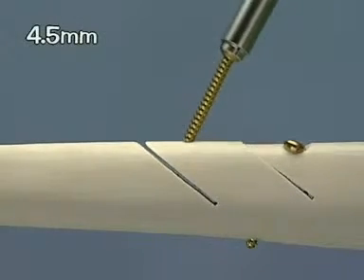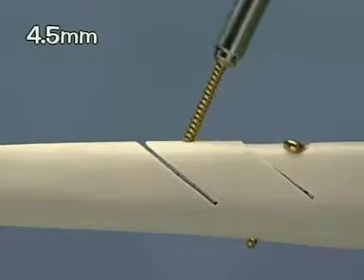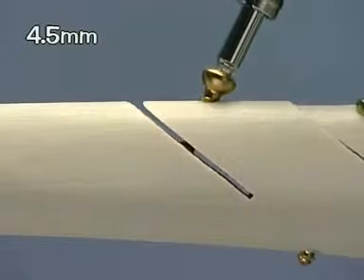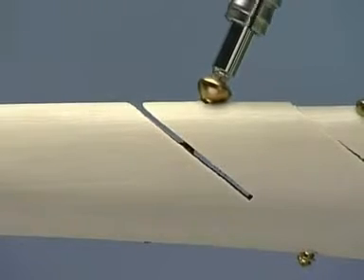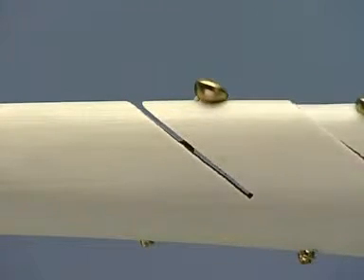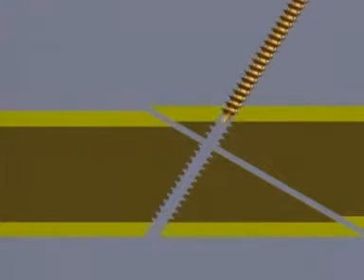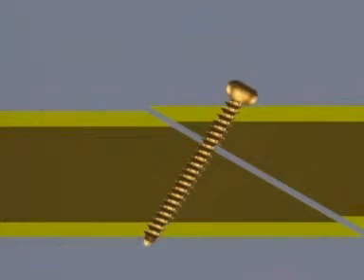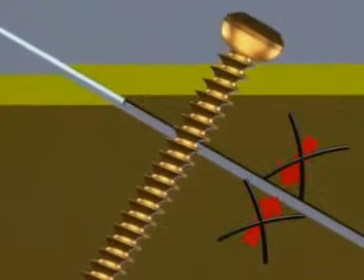Insertion of the 4.5 mm cortex screw. Again, the screw is tightened. The gap will not close because the thread of the screw is engaged in both cortices. This concept is illustrated once again in the computer animation. No compression of the fracture gap occurs. Therefore, this procedure should not be practiced in surgery.